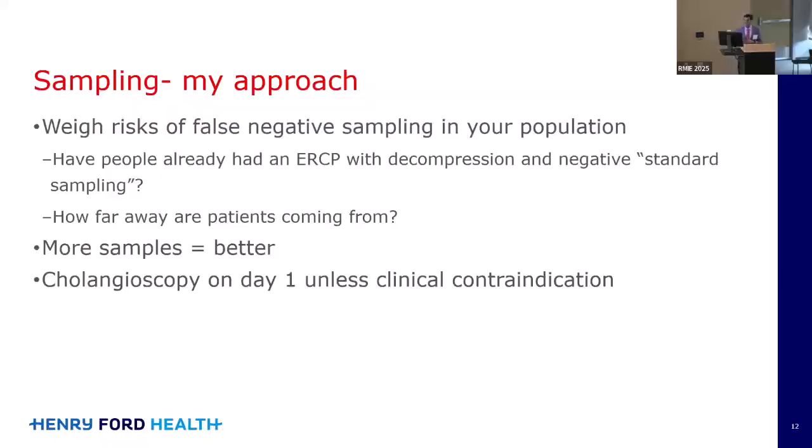It has to be balanced against your endoscopy unit, your technical experience, the cost of performing cholangioscopy. So there's a lot of things to consider. It's not a slam dunk for everybody. This is something that I feel has been a paradigm change in our community in the last 5 years. I see more people going in this direction. It needs to be individualized.